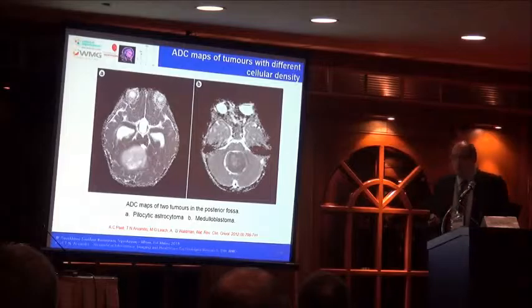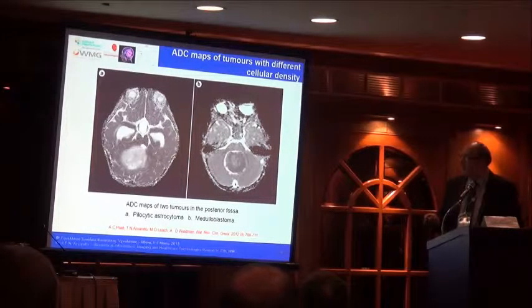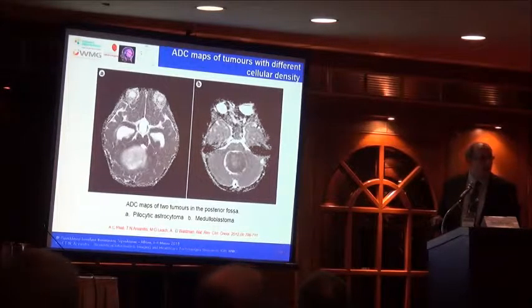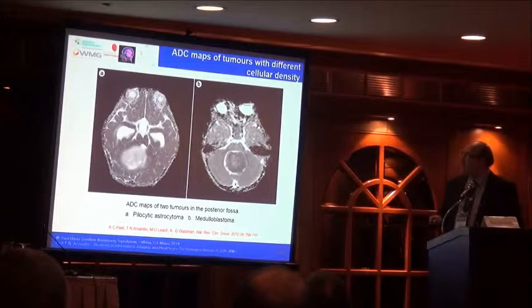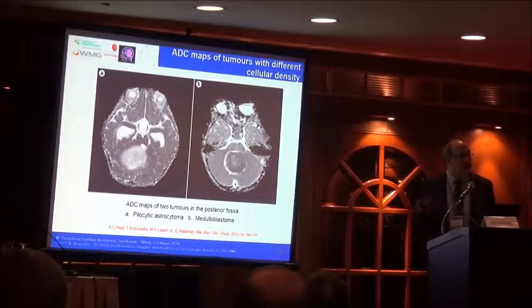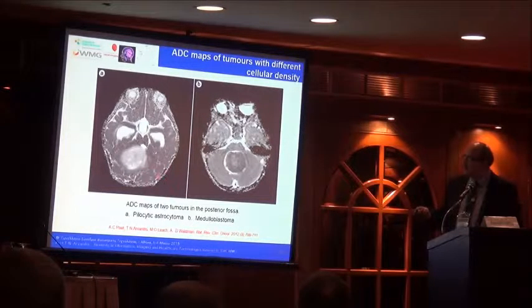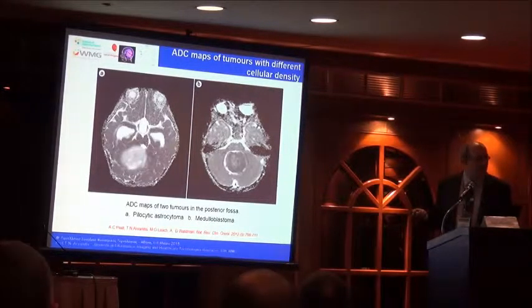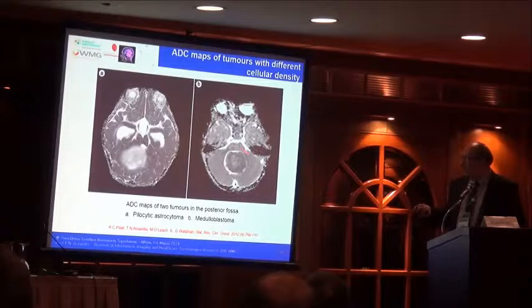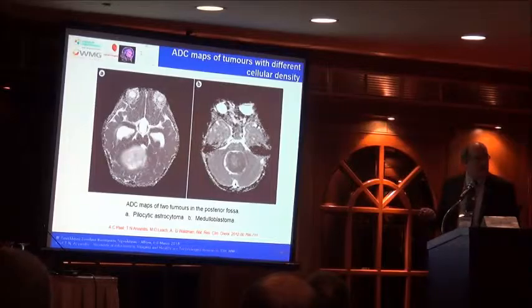Now, I'm coming closer to the imaging side and the issue of texture. If we look at diffusion, and apparent diffusion coefficients is a way to represent diffusion into maps of the brain, then we can understand more about the cellular representation of the tumor. So in this case, the astrocytoma has less cellularity. So this might be a good thing in the way we treat it. While the medulloblastoma has high dense cellularity. So the increased diffusion here maybe is a good sign.